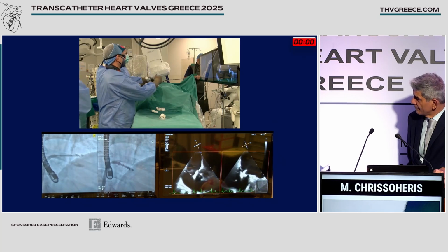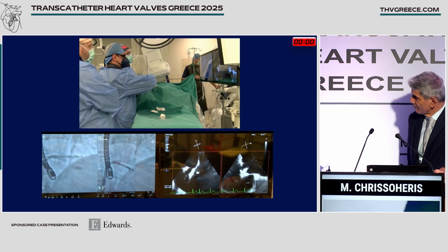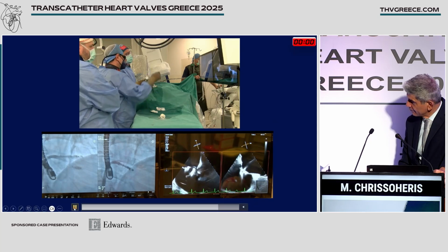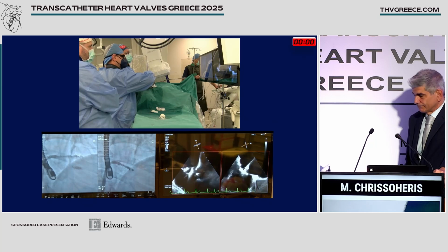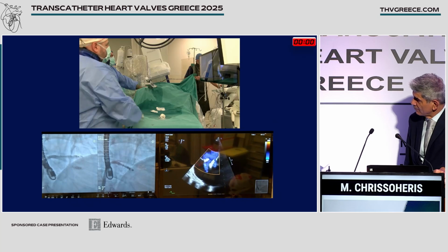Yes. Cordae, correct, in the lower part. That's why I think that area, although it looks okay, if you notice this cordae, this is a hint that you may have a problem to get the septal leaflet rightly and easily. Yeah, that actually showed very well, and I didn't point it out in the transgastric short axis images that we had before. I can go back to that.